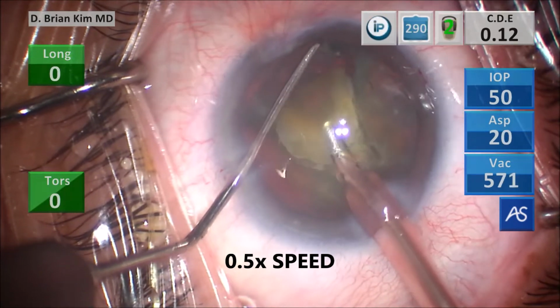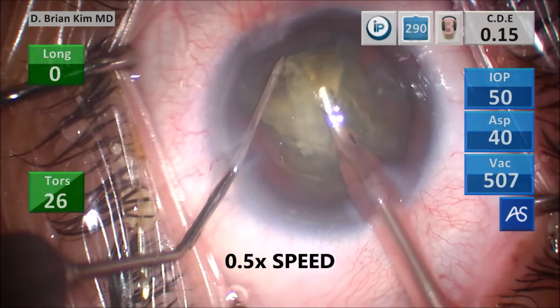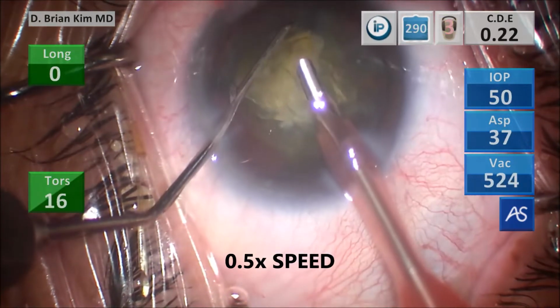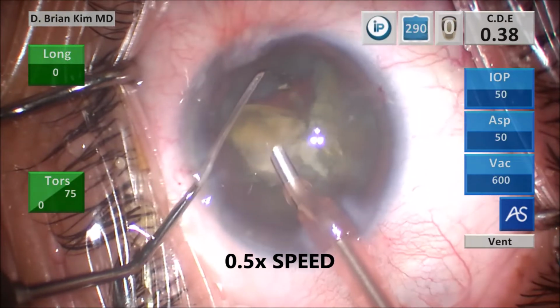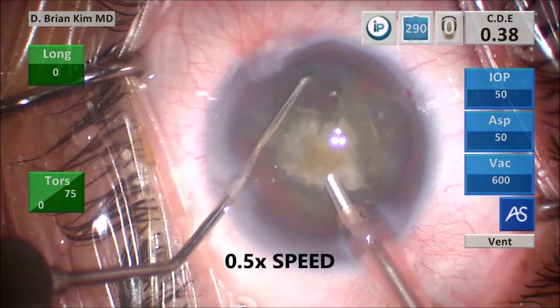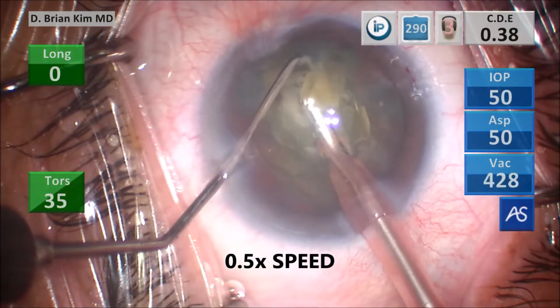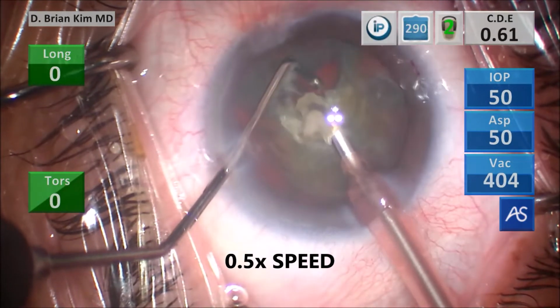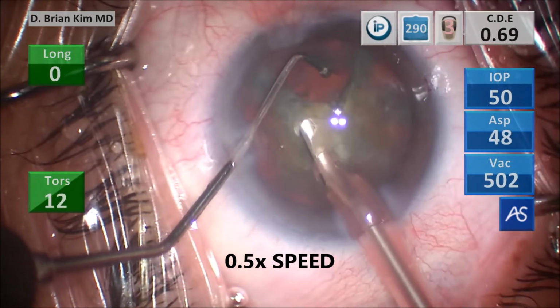I have the chopper around the lens, again, crushing the lens completely in half between the instruments, using some vacuum to grab that second fragment up, crushing the lens once again between the instruments. At this point I'm just using successive fracturing forces, using mechanical forces to crush the lens into smaller and smaller pieces. Ultrasonic energy can damage the corneal endothelium, so maximizing mechanical fracturing forces means you're utilizing less ultrasonic energy, and I'm able to use just sparing pulses of ultrasonic energy as well as high vacuum to remove that lens piece.